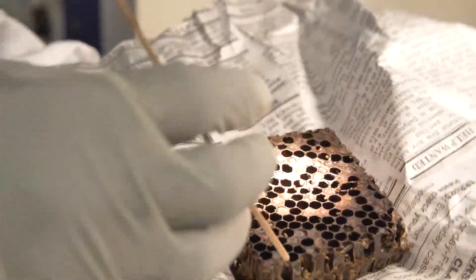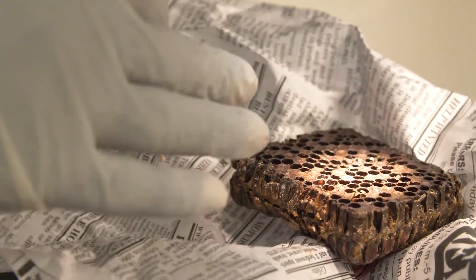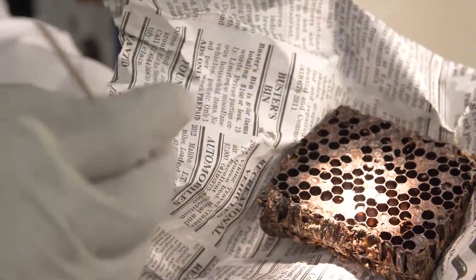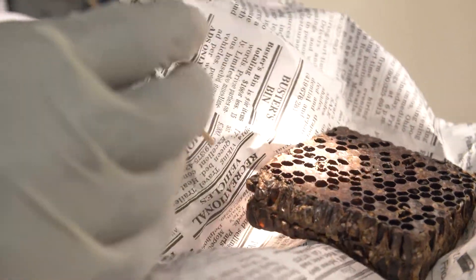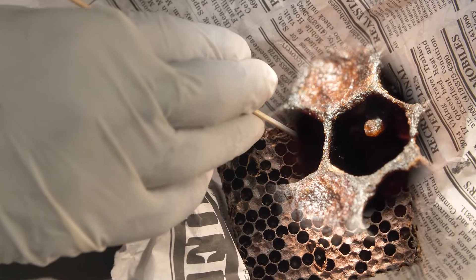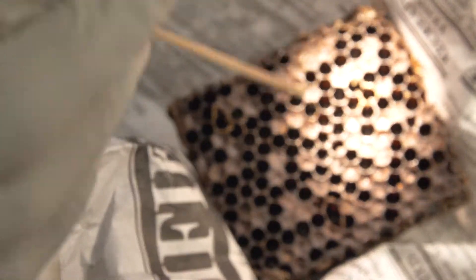Now we want to determine whether American or European Foulbrood disease is present. Our experience tells us it looks more like American Foulbrood present in this comb, but we're definitely going to confirm that with microscopic analysis. We're going to select a cell with pinholes, remove the capping, and look for dead brood. In this case, we can see scale also in the capped brood, which confirms some type of disease — most likely American Foulbrood.